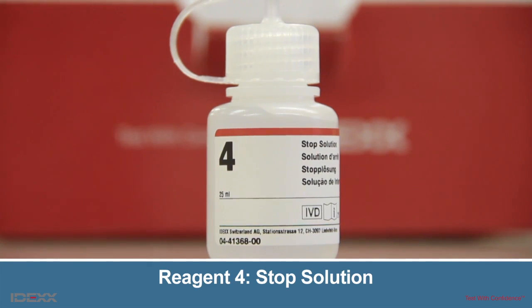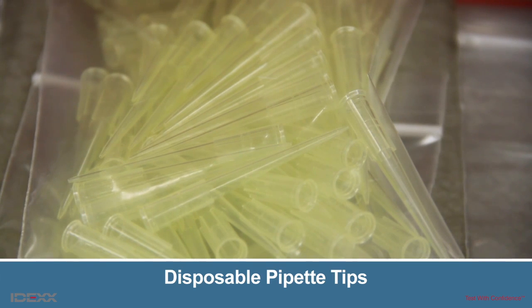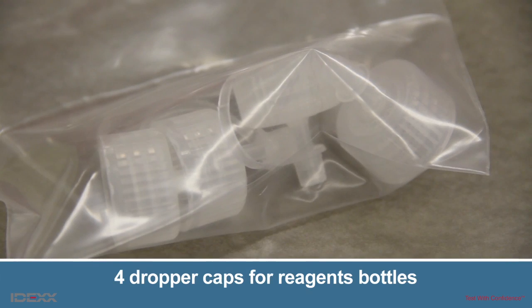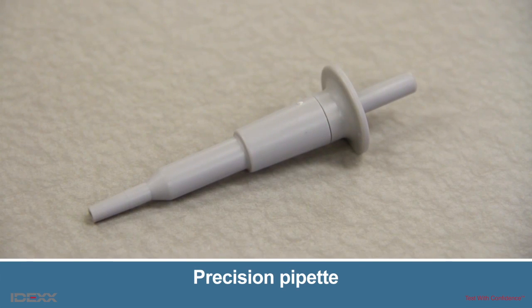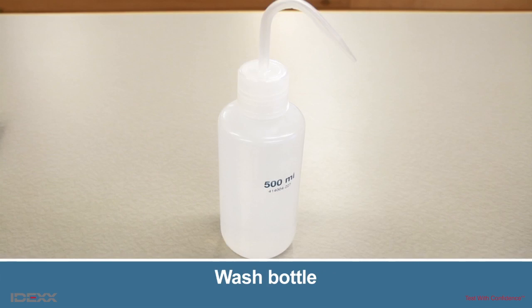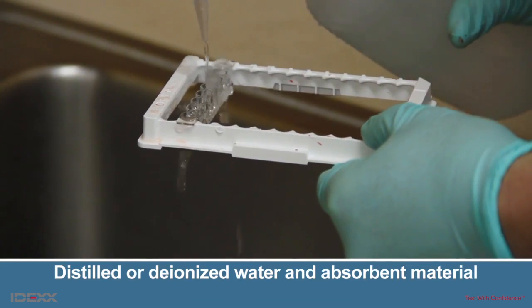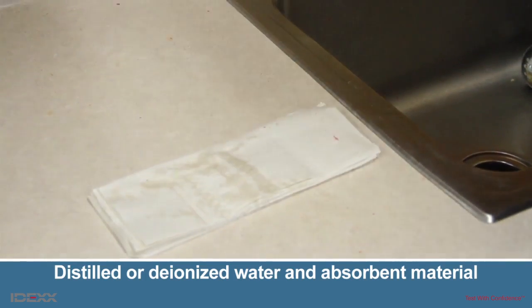Other kit components include a Ziploc bag to place the remaining strips, store strips using the desiccant provided in the foil pouch, 200 disposable pipette tips, and four dropper caps for the reagent bottles. Additional materials needed to run the kit include a precision pipette capable of dispensing 100 microliters, a microplate cover, a wash bottle, distilled or deionized water, and absorbent material for wash steps.